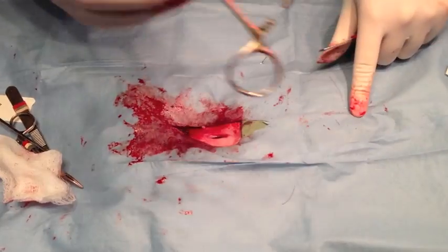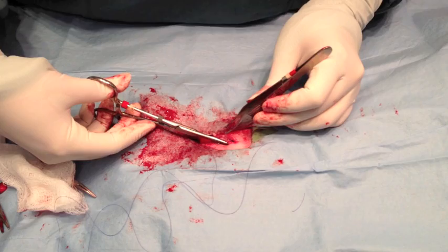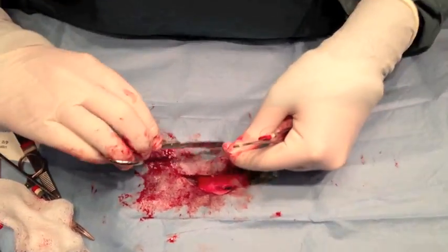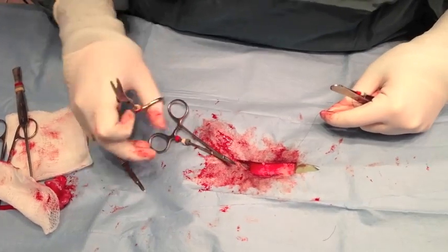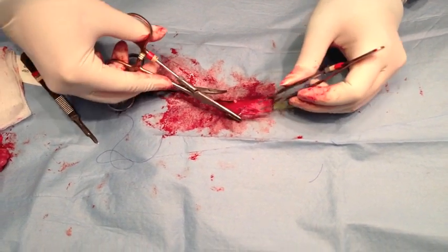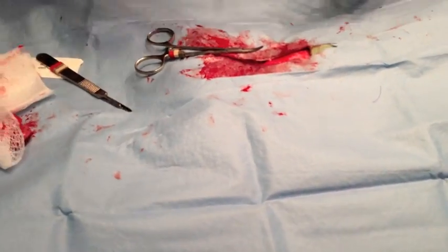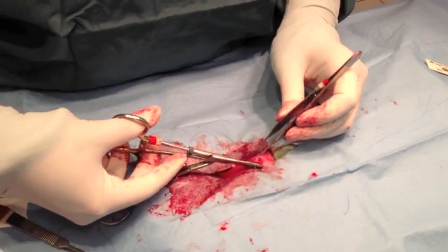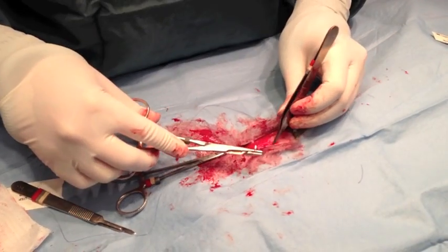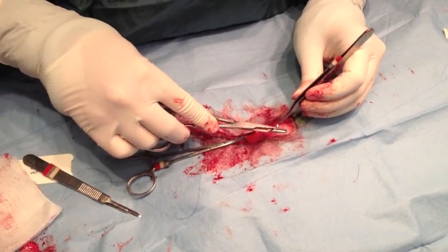The thing that can be a little bit frustrating with closing a rabbit is that the skin is really delicate. Closing the linea and the muscle wall — which is what I'm doing here in this first layer — is very easy, just like closing a cat or a dog, very straightforward. It's when you get down to closing the skin that it can be difficult because the skin is so thin. To me this is the most boring part of any surgery, regardless of whether you're doing a cat, dog, or rabbit. For every surgery it's exactly the same — it gets to be a little monotonous.